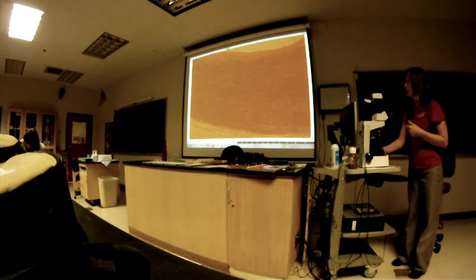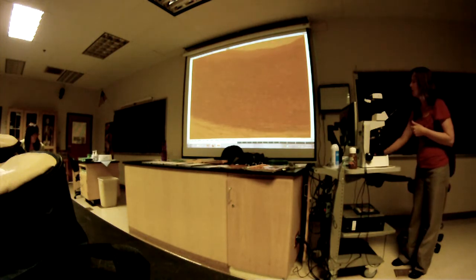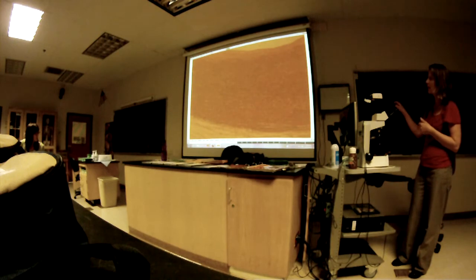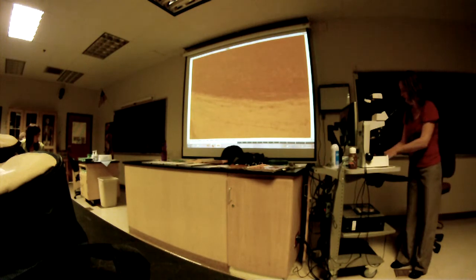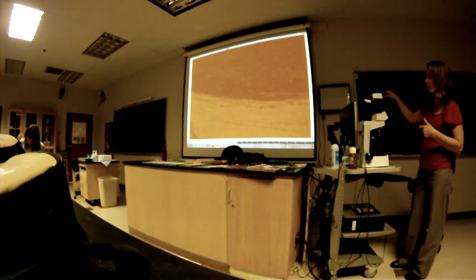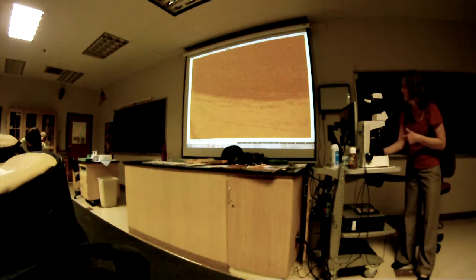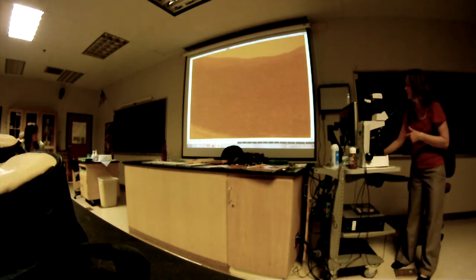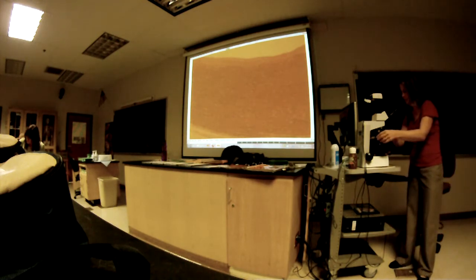Okay, so the blood vessel, we'll go over this soon, I'm not sure if Monday, but the three layers of the wall are the tunica intima, which is on the inside and not really shown here, tunica media, and then the outer layer is the tunica, has a couple names, tunica externa or adventitia. Okay, so this one, smooth muscle in the tunica media and the elastic fibers. That's the aorta.